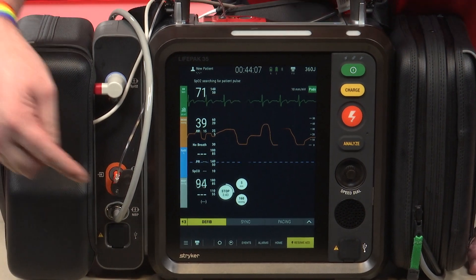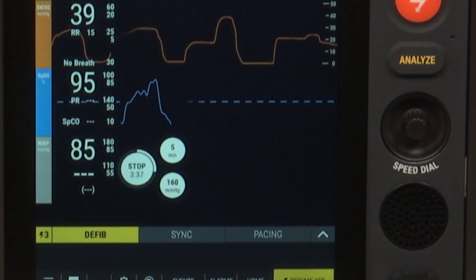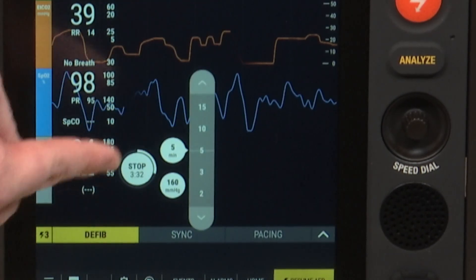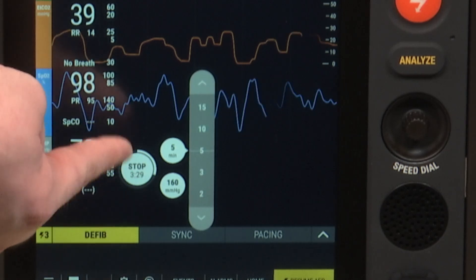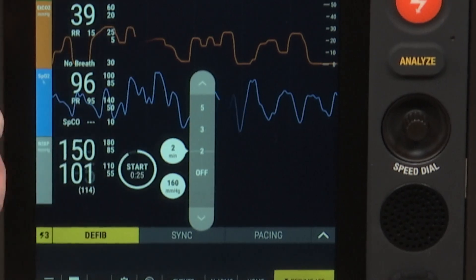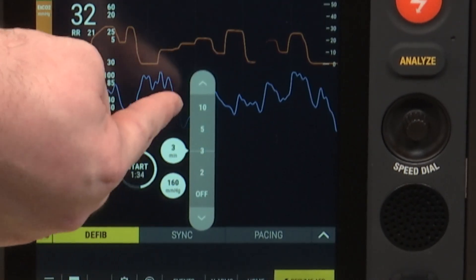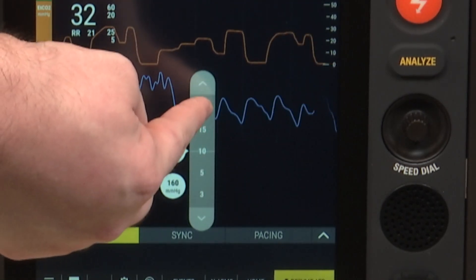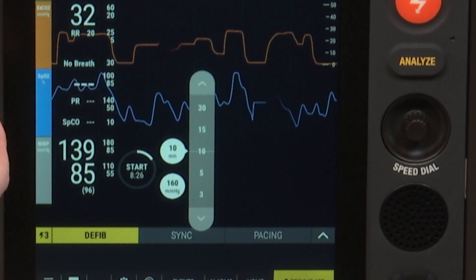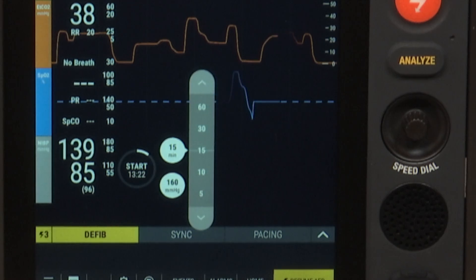Other things with the blood pressure: next to the start button there are two other options. The top one is the time interval — how often it will take a blood pressure. If I click on that, I get different time options. I can take it as often as every two minutes or as infrequently as every 15 or 30 minutes. Currently I have it set to five minutes, but if I wanted to switch it to every 15 minutes, I just press 15 and it changes on the screen.